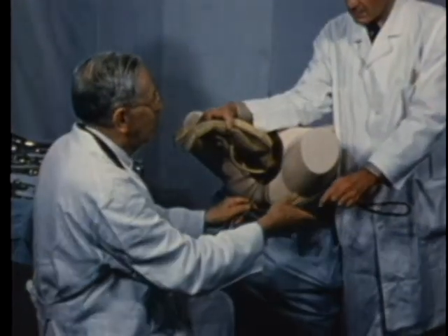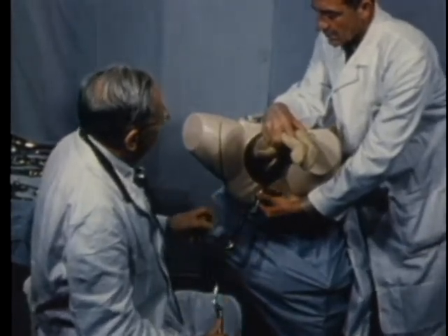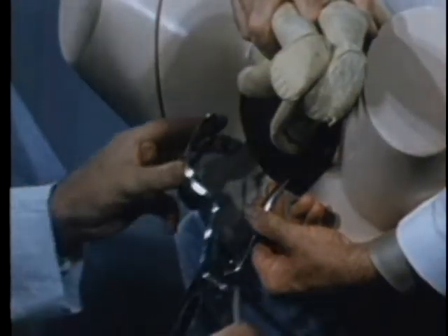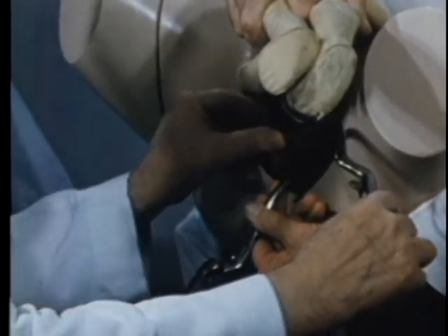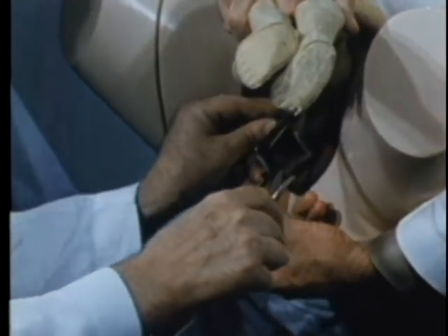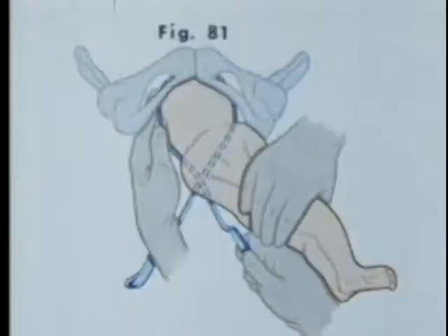Once in place, the assistant carries the body to the opposite side, exposing the approach to the right side of the patient for the introduction of the right blade, with the handle held near the left thigh and carried inward, brought around to the midline and dropped into locking position.